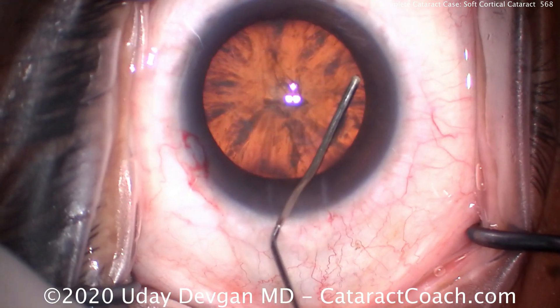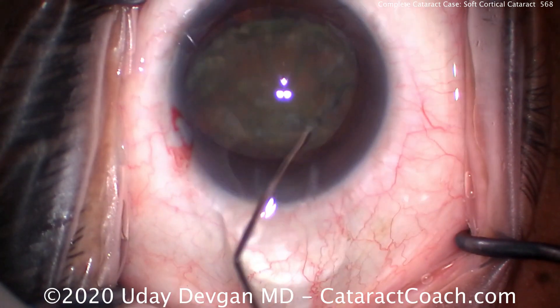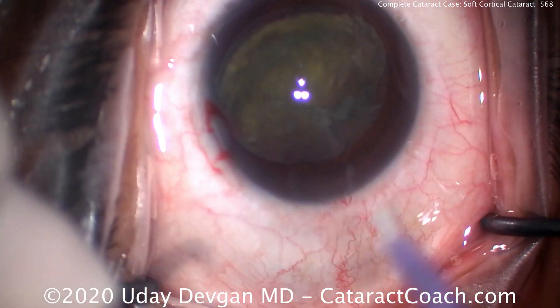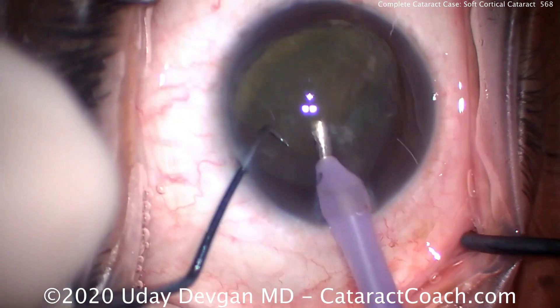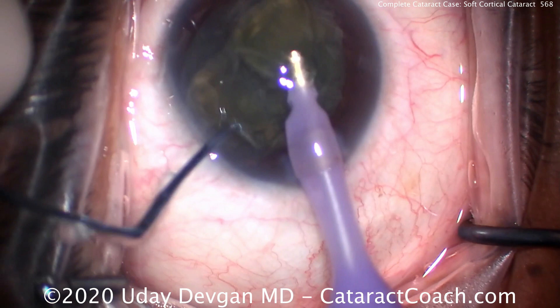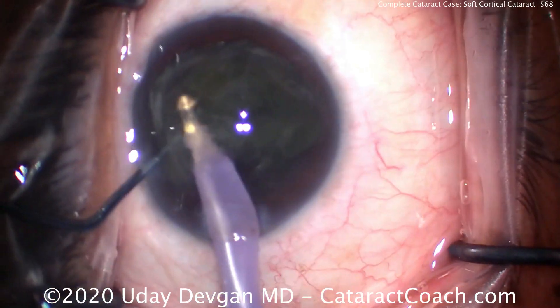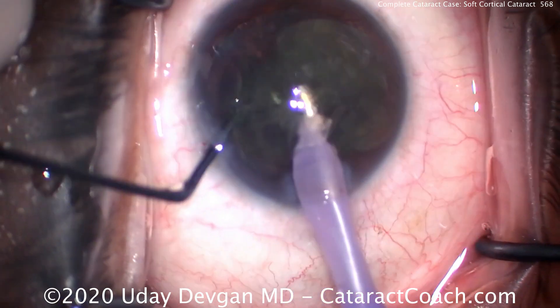Here's the hydrodissection. We'll do a nice, thorough hydrodissection. There's that total opacity. We definitely want to get the lens out of the capsular bag here because it's relatively soft — we don't have to work in the bag. There's going to be a minimal amount of phaco energy, so we'll use a very moderate phaco setting. We can try to chop the lens and it chops easily. Using high vacuum and high flow, we can emulsify and aspirate the lens very quickly.